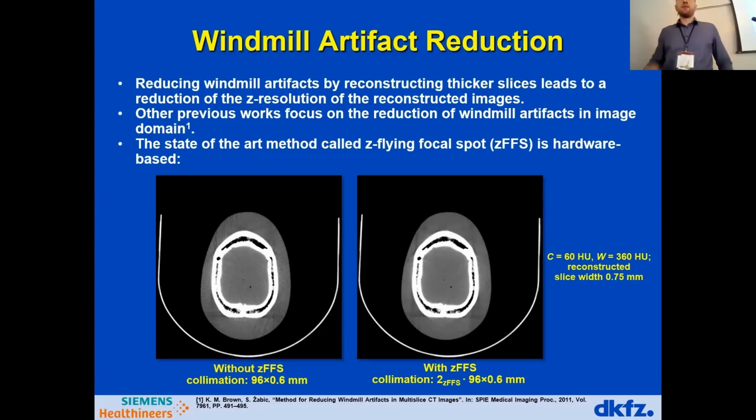No, what I was saying is that the higher sampling reduces the artifact. I don't know about the higher frame rate. Okay, so what would you do to increase the sampling?